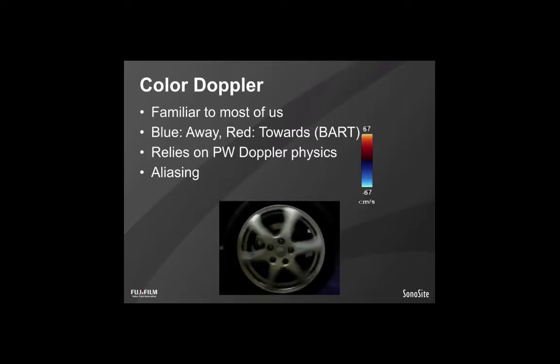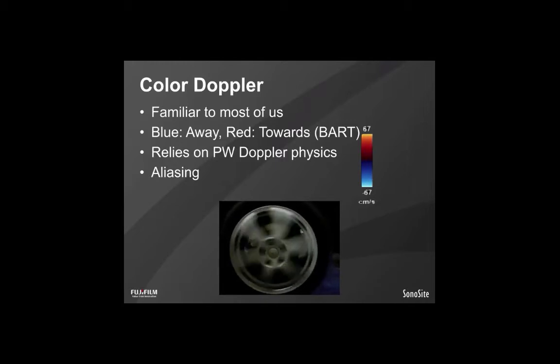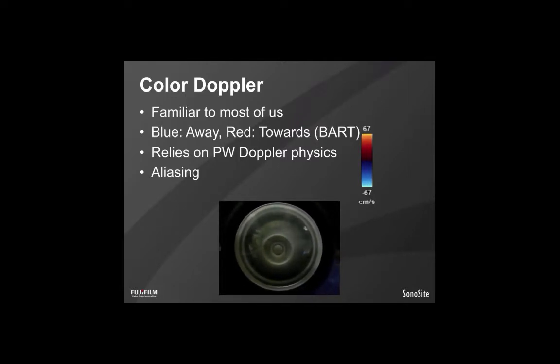This is familiar to us from more day-to-day encounters when it comes to other fast-moving objects. For example, in this case, the wheel of a race car, where the sampling rate of the video camera, the frame rate, has an upper limit, and it's seldom exceeded, except when you get revolutions as quick as this wheel does. And as you'll see, the wheel right now starts turning the opposite way, despite clearly that being impossible.